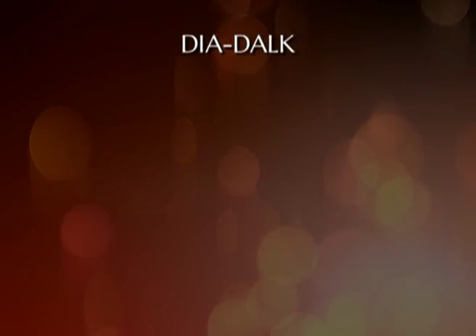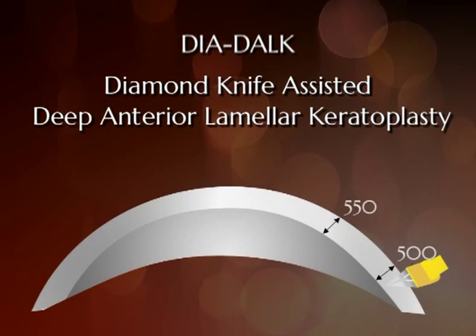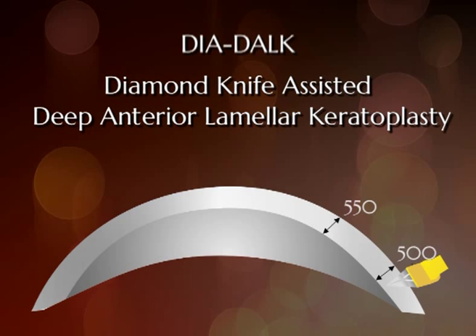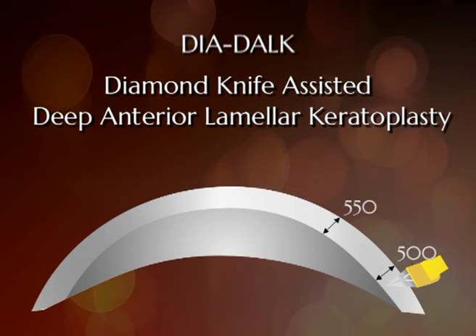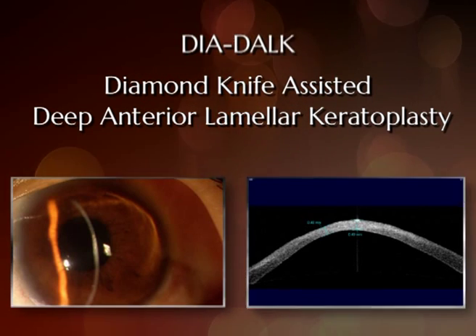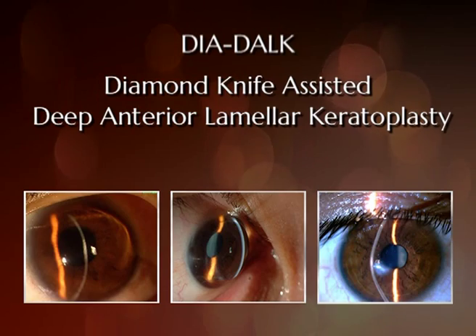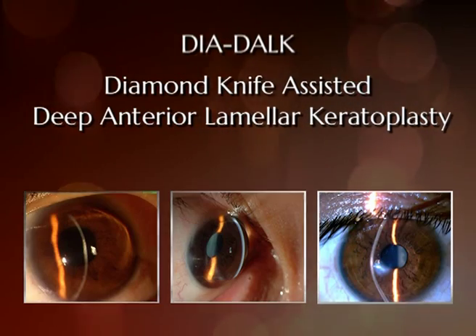Herein we describe a new technique of DALK, the diamond knife-assisted deep anterior lamellar keratoplasty, or DIA-DALK, for the management of keratoconus. This technique is safe, provides visual outcome comparable to big bubble DALK, and can be done even in cases of extreme corneal thinning or corneal scars.